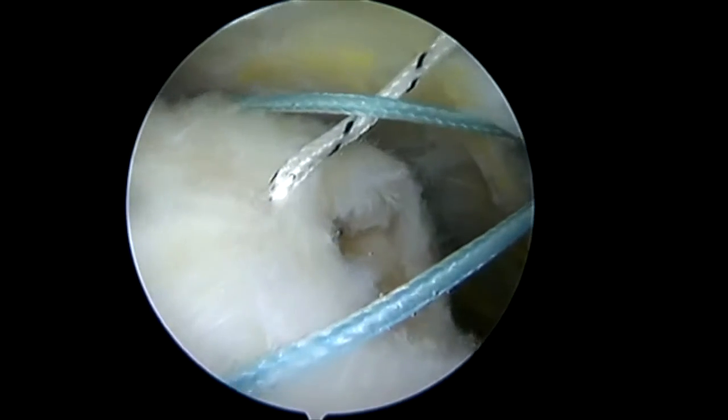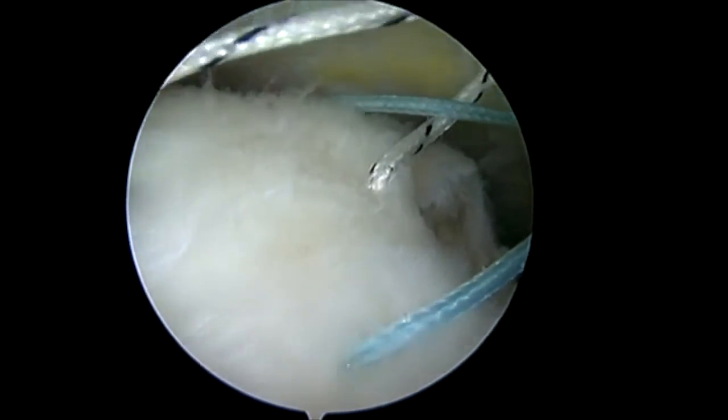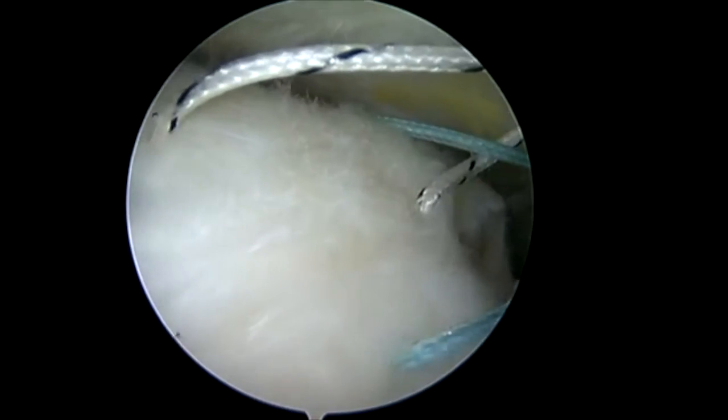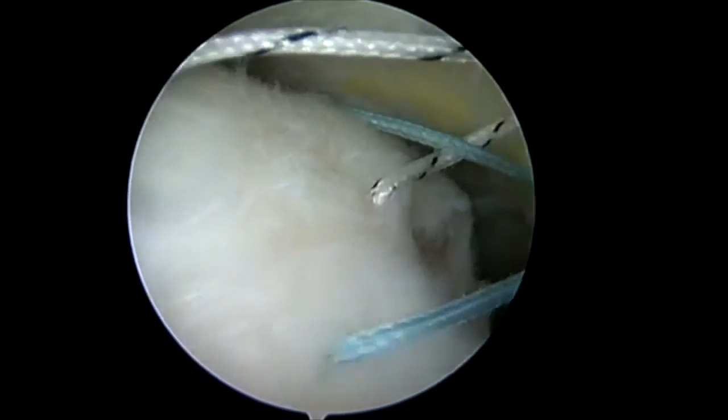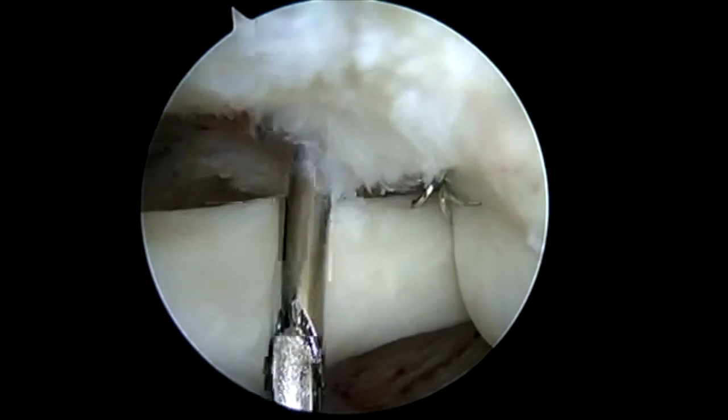But again, we're dealing with very deficient tissue. The rotation device comes with tendon staples and insertion cannulas for these, as well as bone staples. The insertion cannulas are placed through accessory portals.